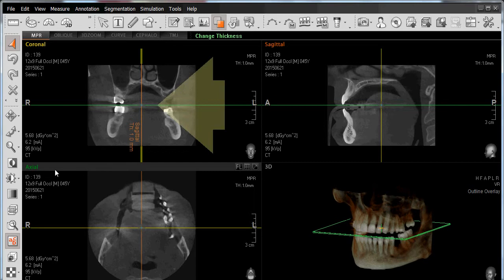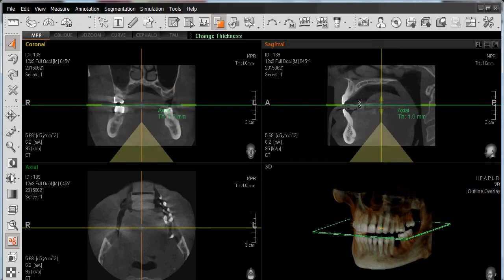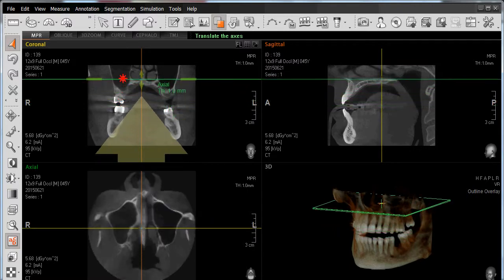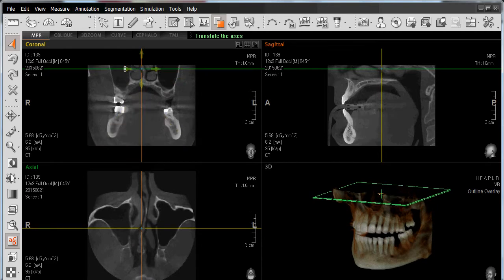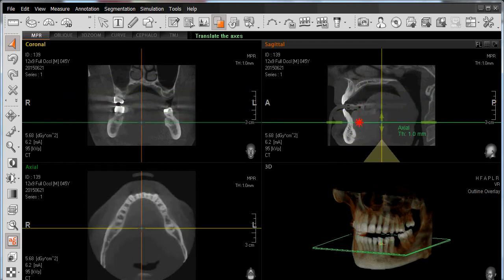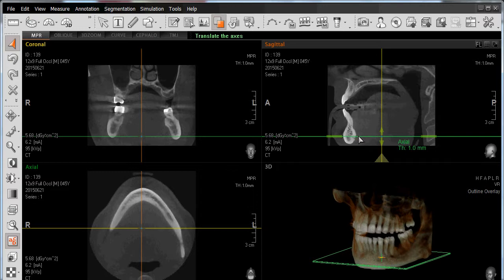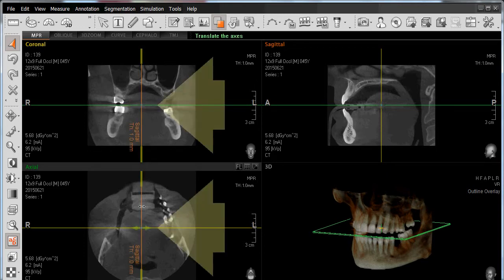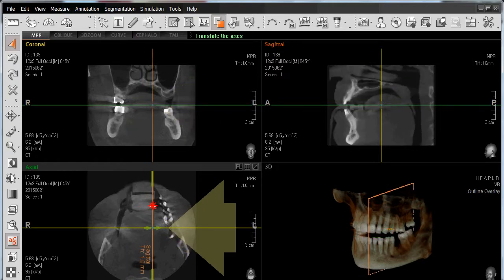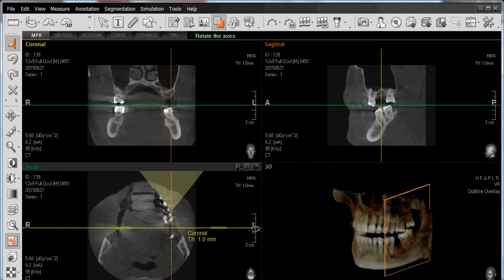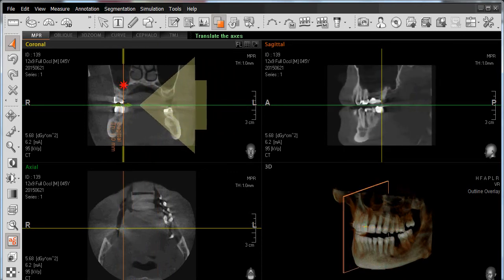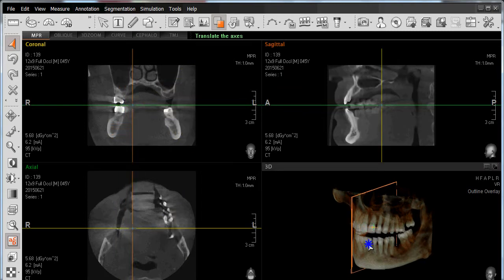Let's do the same thing with our axial view. Identify the green line to define our view and navigate either superior or inferior by left-clicking on the green line, dragging it up into the sinus cavity towards the superior border of the field of view, or dragging it down towards the occlusion and eventually into the mandible. To navigate through the sagittal view, simply identify the orange lines in the coronal or axial view, left-click, and drag towards the left or right side of the anatomy. Note how the view changes in real time in all windows, including our 3D rendering.